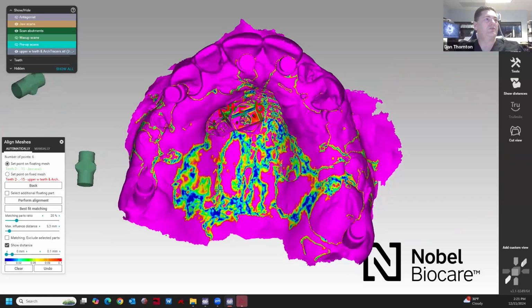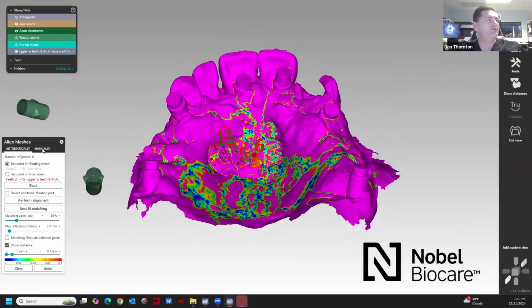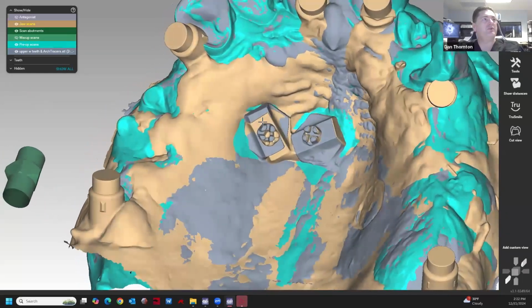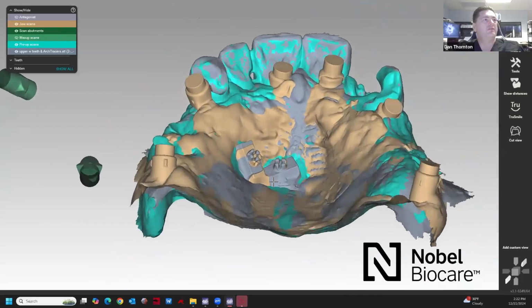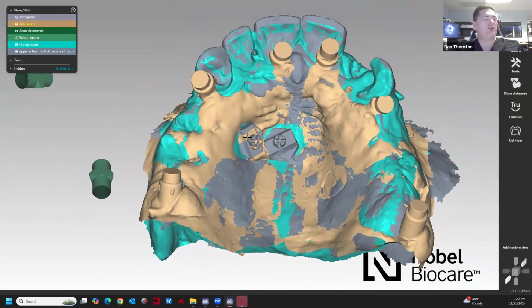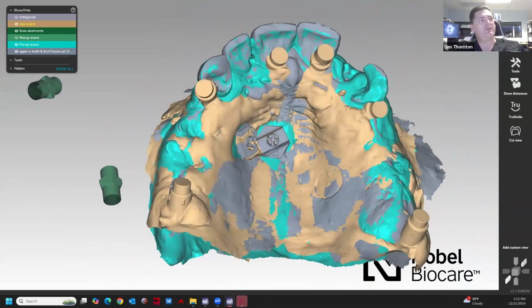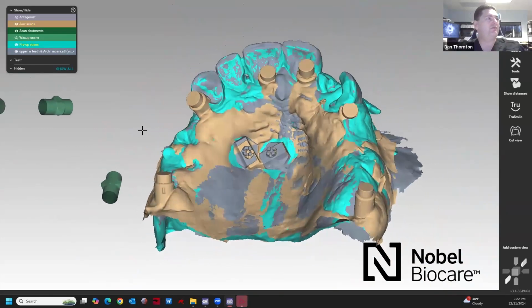All right, we still have some good tissue area that wasn't disturbed too much. And you can see one actually looks pretty good. This one kind of moved a little bit. The second one was actually more of a backup. You can run with one, but I prefer to have two. You can see they tried one over here, but the palatal bone wasn't strong enough. And it's probably what happened here. It just got knocked out of the way a little bit.